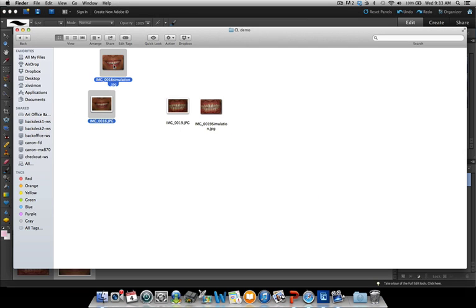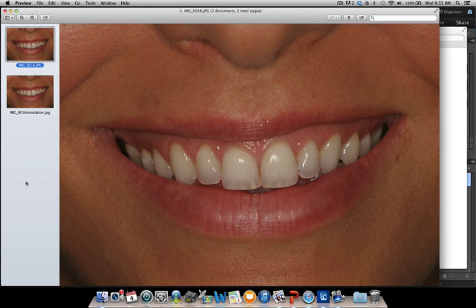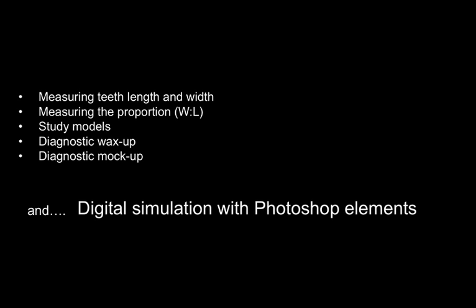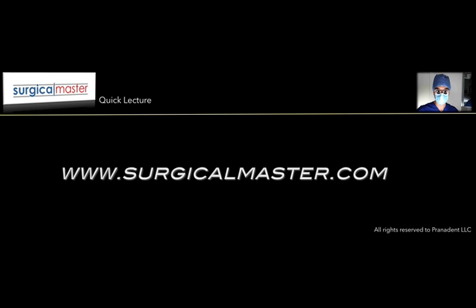Do the same thing with the smile photo — open both files and toggle between the two, and you can help the patient visualize what the crown lengthening will look like. It's very simple using Photoshop Elements to create a digital simulation and help you make decisions about where the ideal gum margin would be. I hope this information was useful, and that you can now go ahead and do a digital simulation for your patients and eventually perform a better procedure. Until next time, all the best — Ziv Simon from Surgical Master.